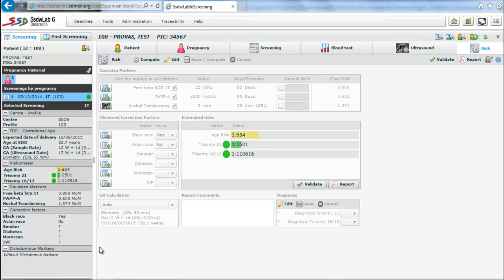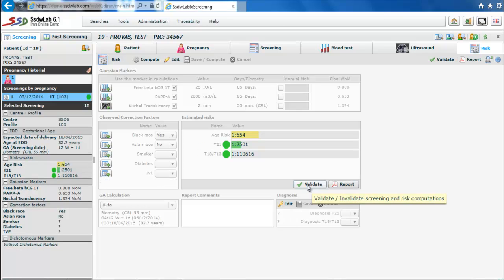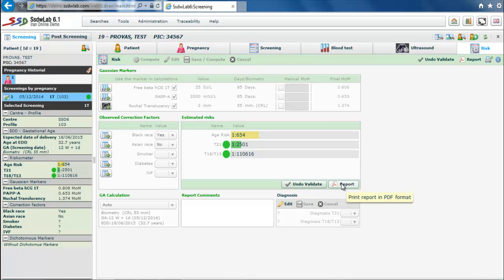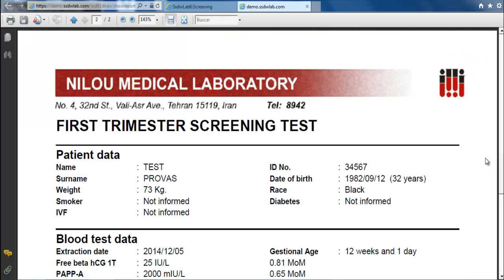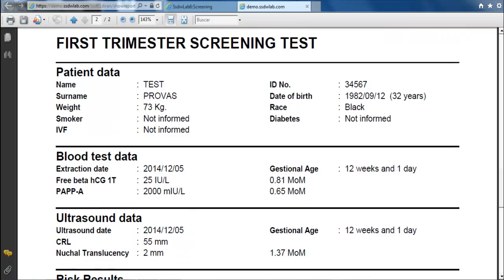We can observe the presence of two buttons. One is the validate button for validating the screening, and the other is the report button. If we click the report button, a report in PDF format is generated in a new tab.